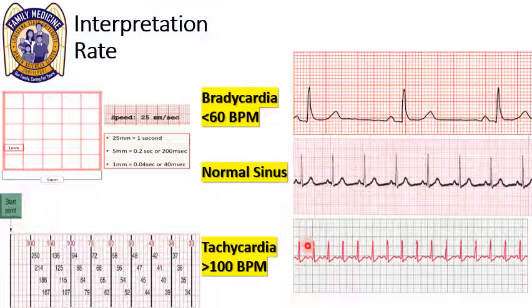Sinus tachycardia, same thing. We have already mentioned that it's between 150 and 100. And you can see a P wave. That's another important point. SVT and AFib, A-flutter lose their P waves. So you have your P wave, you have your QRS.